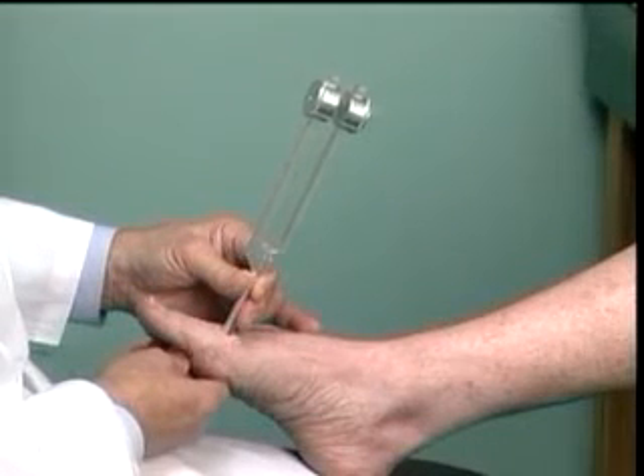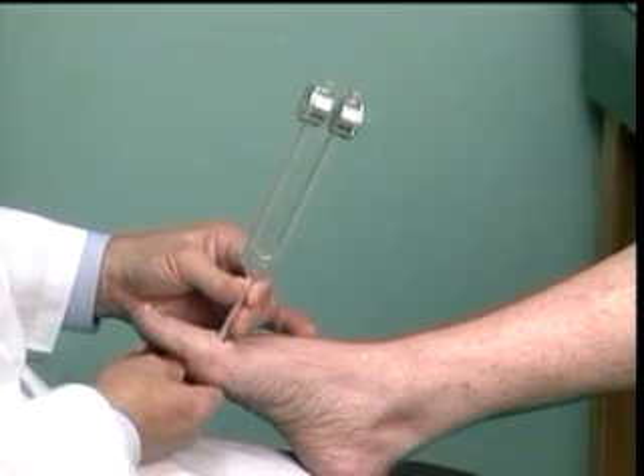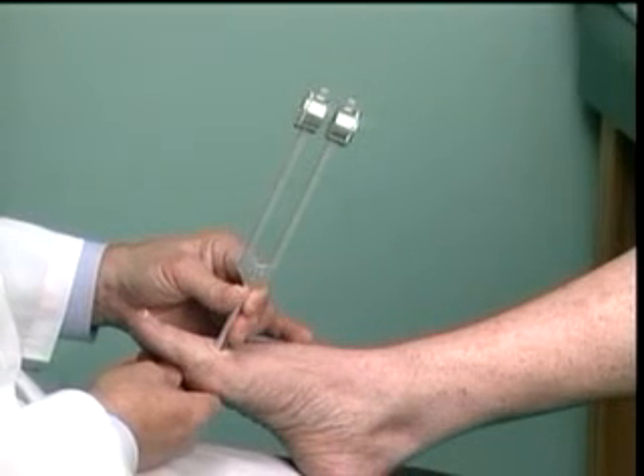The test is now repeated on the first metatarsal head, checking for a loss of sensation. If the patient doesn't perceive when the vibration stops, this indicates a loss of vibratory sensation.